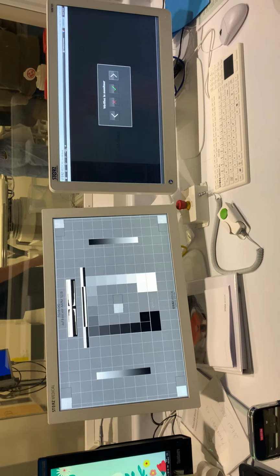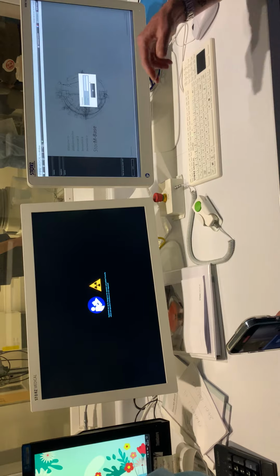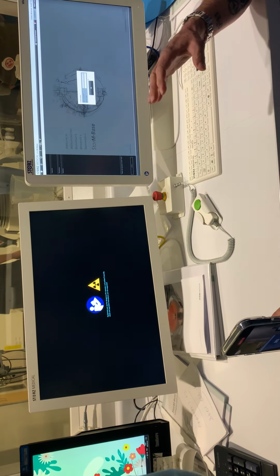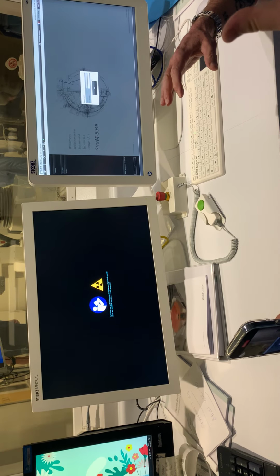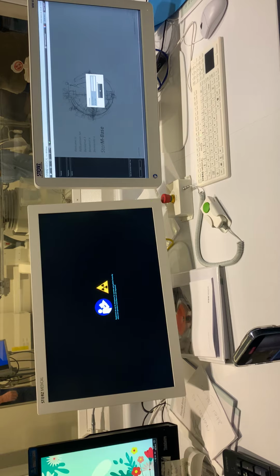Now your question, excuse me. Yes, so when it says check the monitor like this, what do we need to see to say it's all right? Do you see any pixel errors? Is the monitor too dark, too light, or something like that? Yeah, you need to have a good image quality.